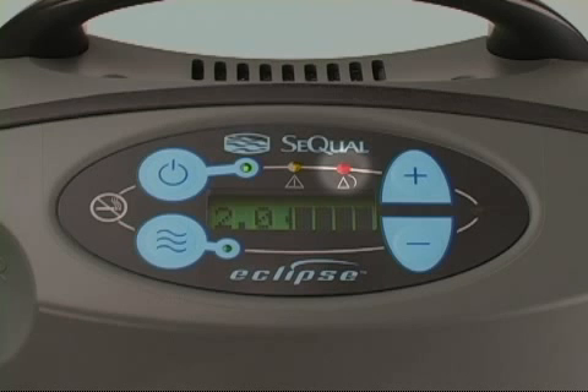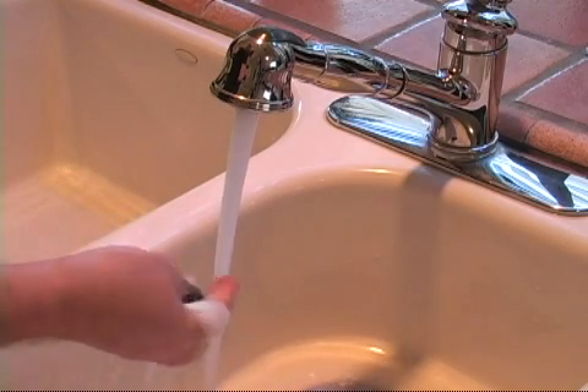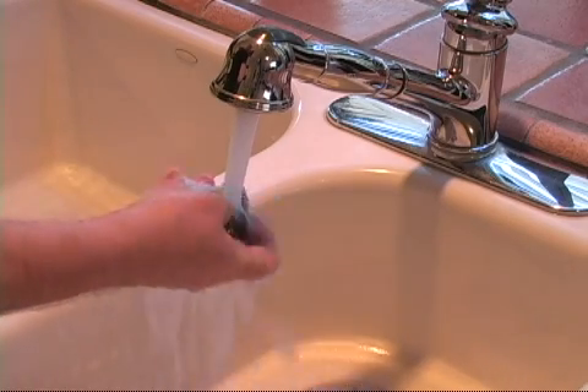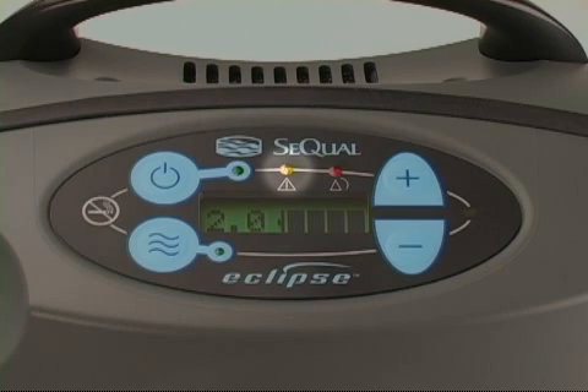If the oxygen concentration drops below 70%, an audible alarm will sound and the red indicator light will flash. To remedy this condition, clean the air intake filter. If the condition persists, contact your home care provider.